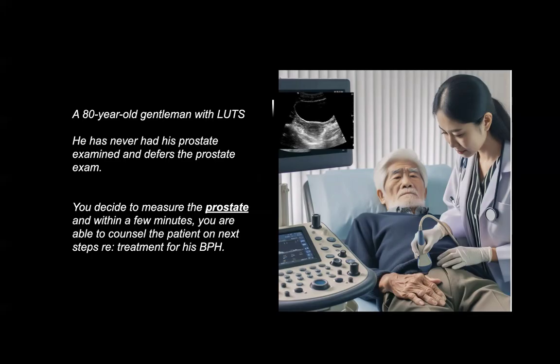Now let's talk about, while we're in this realm of looking at the bladder, what's inferior to the bladder and next to the bladder, right? You can actually answer multiple questions when you are looking at the bladder itself. And so here's another case, an 80-year-old gentleman with lower urinary tract symptoms. He's never had his prostate examined before. However, of course, he adamantly defers this prostate exam because it is very invasive.